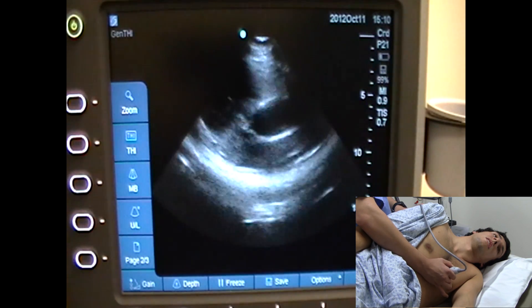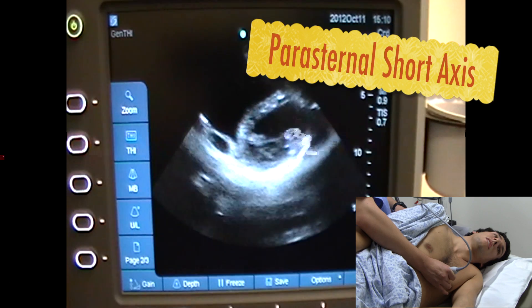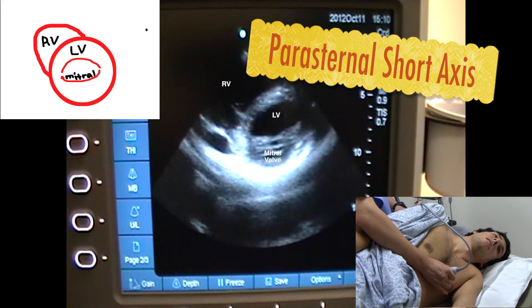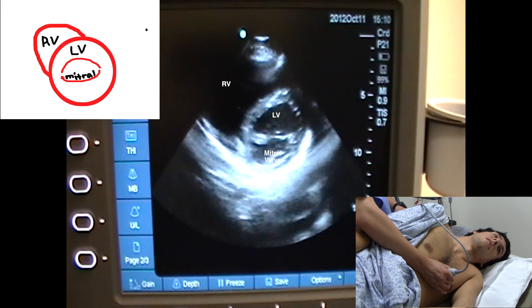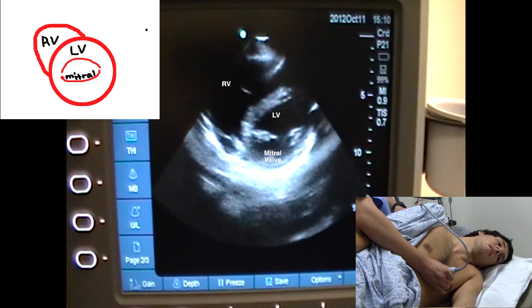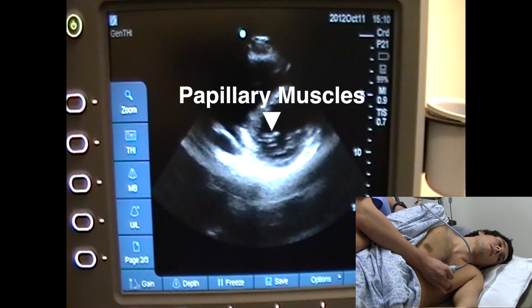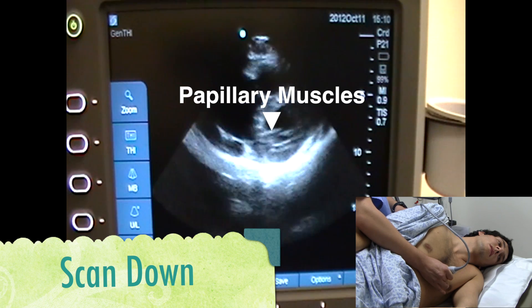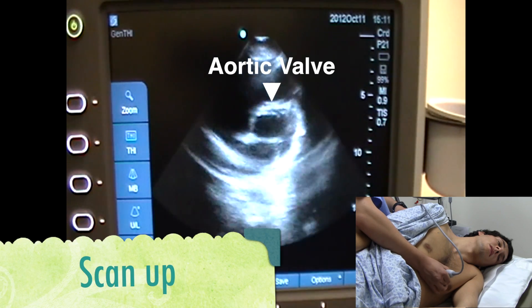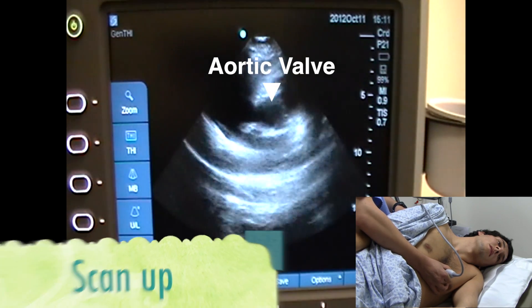Now I'm going to turn it 90 degrees to get a parasternal short axis view. In this view, you can actually see the left ventricle in cross-section, which is on the screen right now. What we're seeing right now is the mitral valve — you see how it looks like a fish mouth? That's called the mitral valve. If you scan down a little bit lower, you'll start seeing papillary muscles. And if you scan up more past the mitral valve, you'll see the aortic valve.